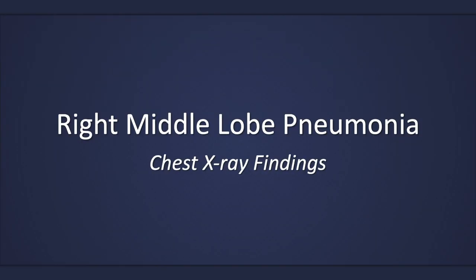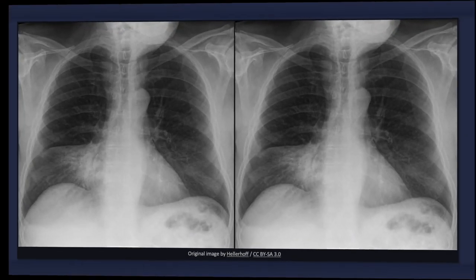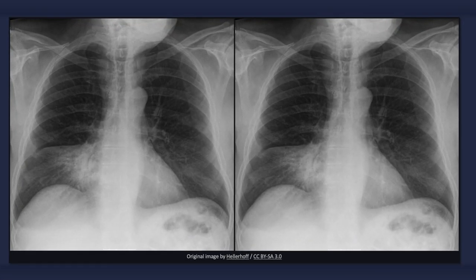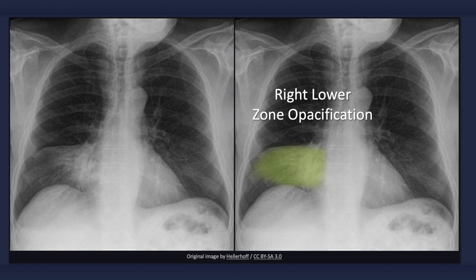This lecture will describe the classic chest x-ray findings associated with a right middle lobe pneumonia. When presented with an x-ray of a patient with right middle lobe pneumonia, the first finding you may notice is an area of consolidation. The presence of fluid density material within the right middle lobe results in a wedge-shaped opacity in the right lower zone adjacent to the heart.